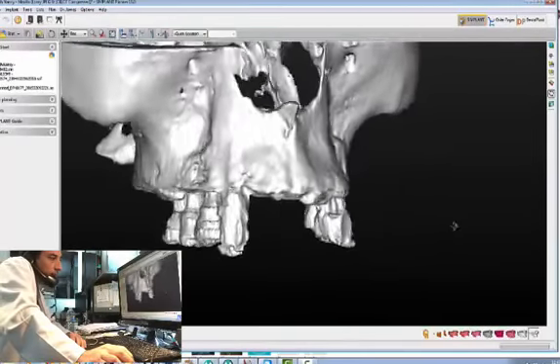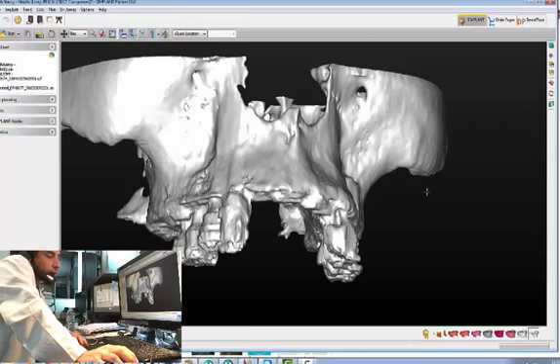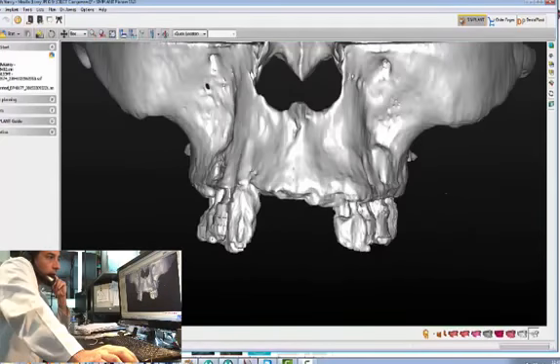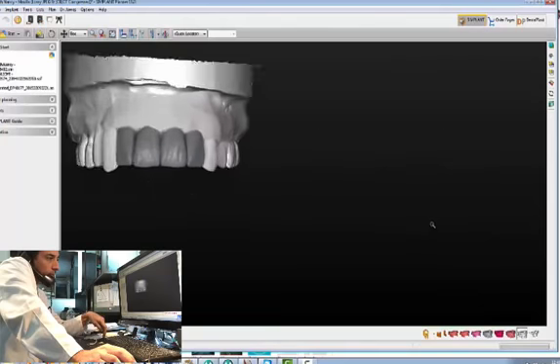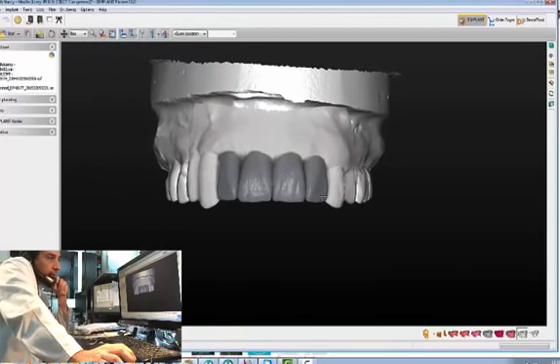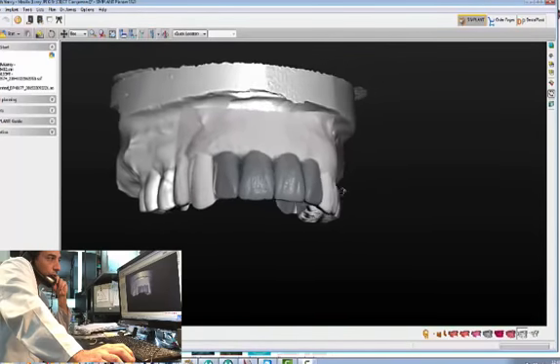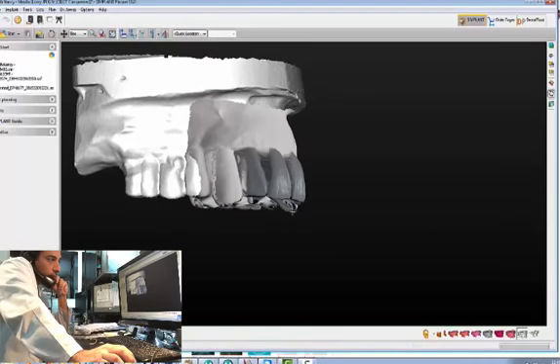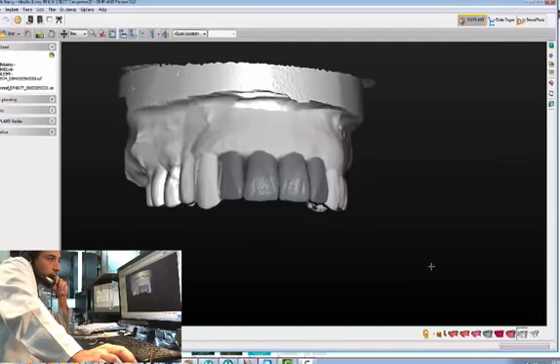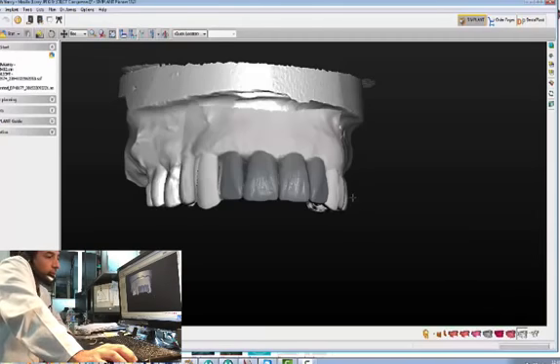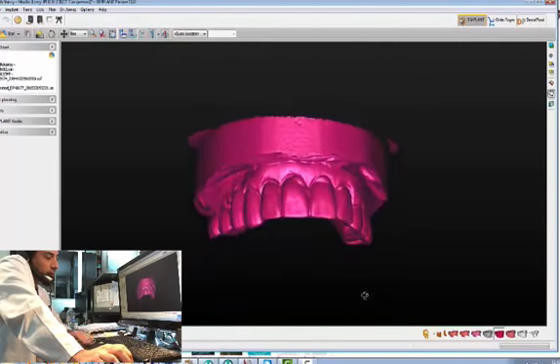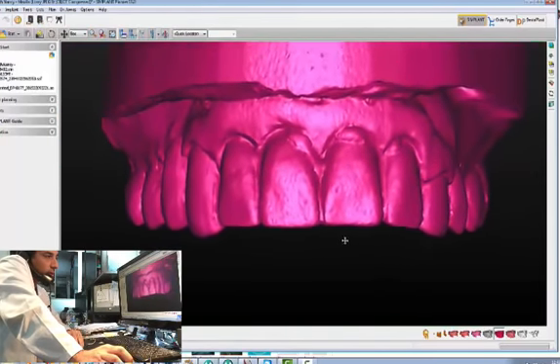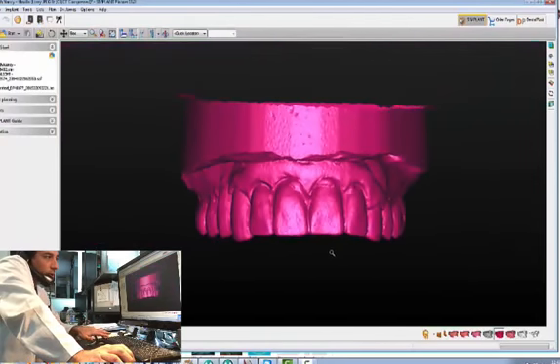Let me give you a little bit of a review of what we are looking at. We have Nancy's CT scan, which is DICOM data. I have a wax-up done by Sam waxing up all four teeth, and that is stitched to basically a model — you can see the stitching point. This model is just to give Sam some idea about where the teeth should be. I took an alginate impression of the partial and sent it to Sam because she likes the position of the teeth. It helps the technician to create a wax-up, but we are not going to use it for the planning process.